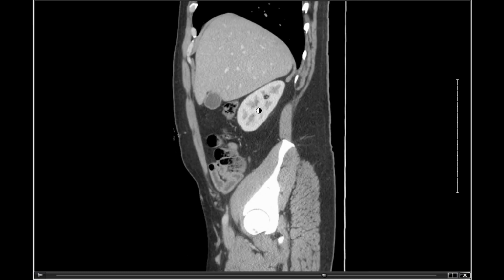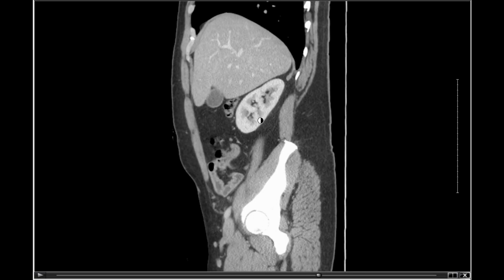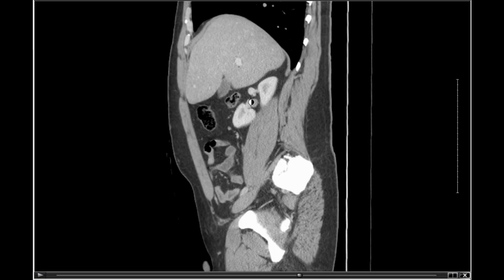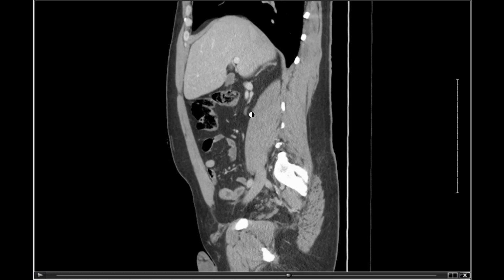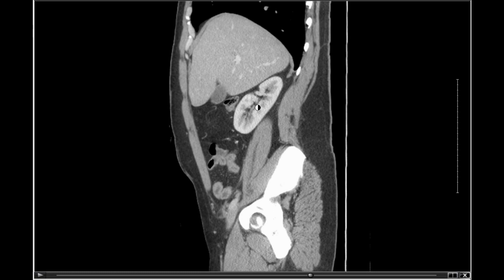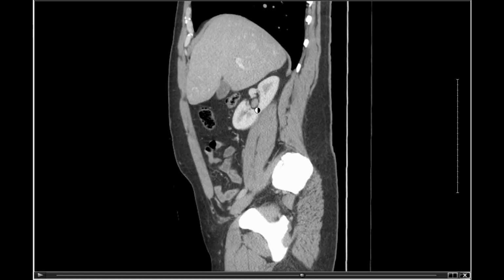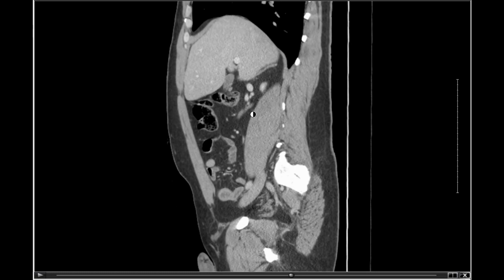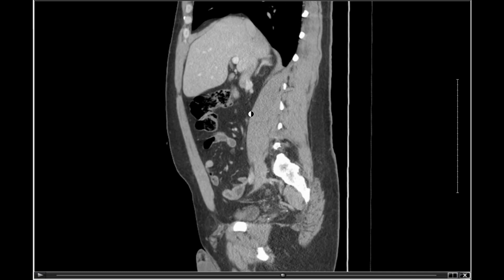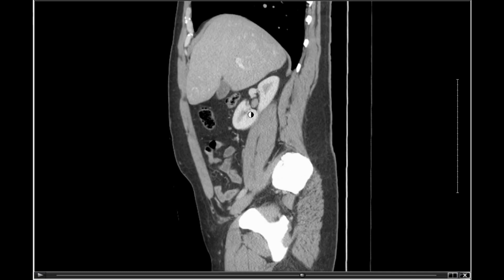And there it is. One cool thing about this view is we can actually see my right renal vessels right here. We can kind of follow those as they go into, boom, the substance of the kidney there. And we can even see my ureter departing right there. See this little squiggle? So let's follow him a little further down, see how far we get.